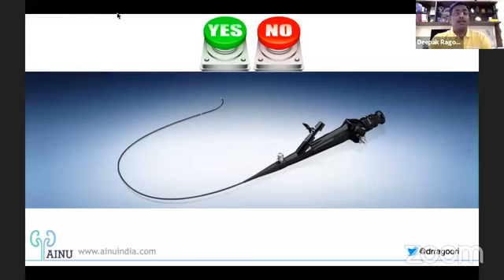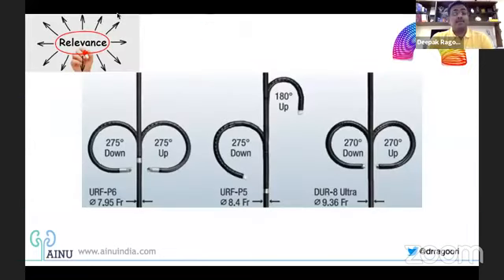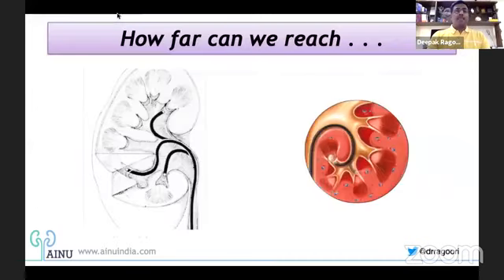normally hold back, considering the fact that the advancements in ureteroscopes, like Tanuj was just speaking about, they're just going from one place to another, they're getting more advanced, the flexibility, reaching different parts of the calyces, I guess is no more a task because the thinness of the scopes is so much that reaching a part of a kidney is not a task at all.